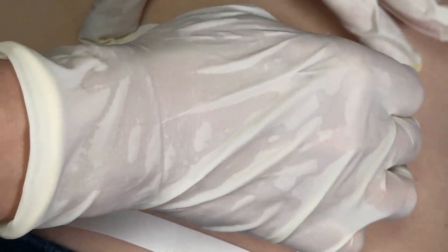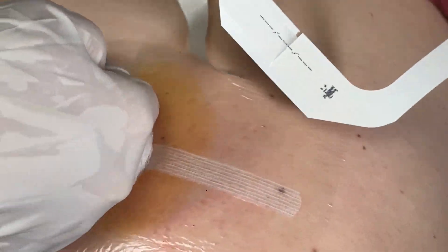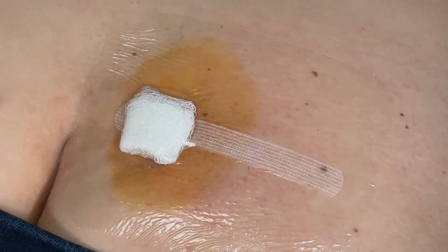If you're sore, use ice. You might have some bruising and some soreness, but that should all go away. And there we go — you are done!